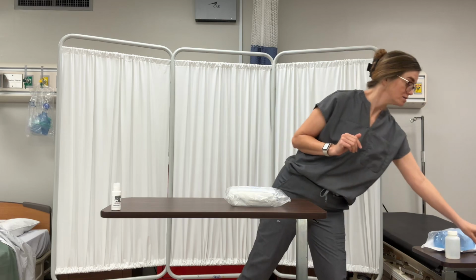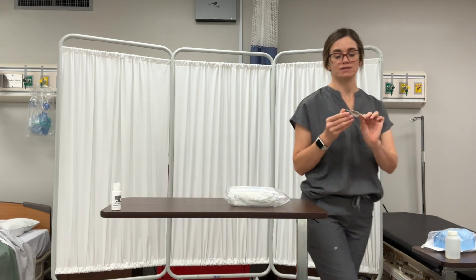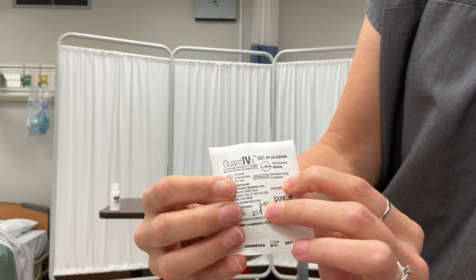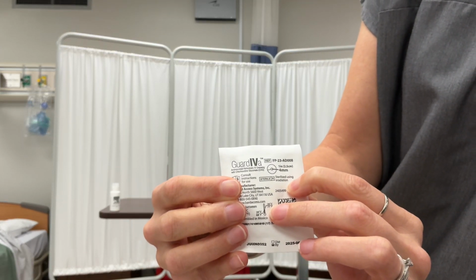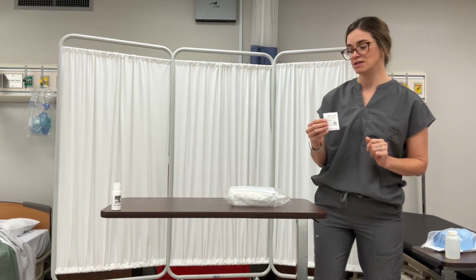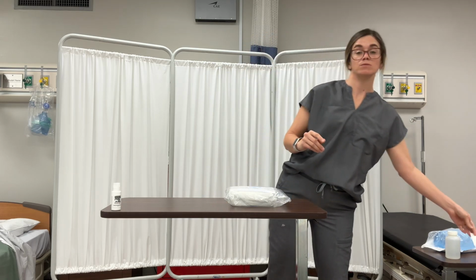How you know that something is sterile is you're going to make sure that it is labeled as sterile. Make sure you can see this. If you look, it says right here, sterilized. Can you see it on there? Any item that you're using has to be labeled as sterile for it to be sterile. There are items that we use in hospital facilities that are packaged but not sterile, so you need to make sure that it is sterile.